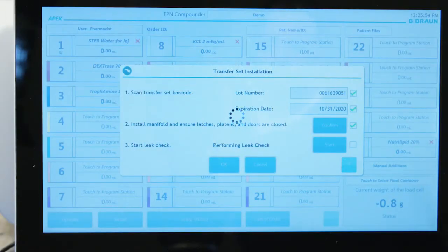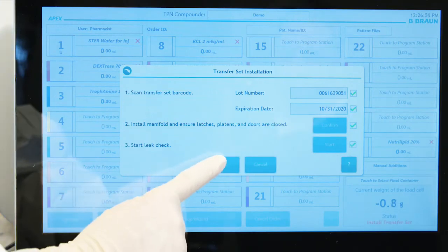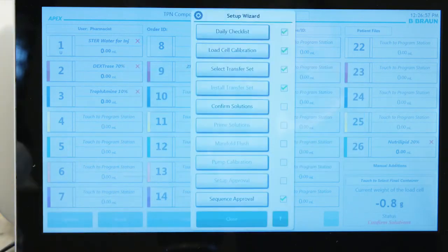APEX will then perform the second part of the leak check to ensure the integrity of the transfer set. When APEX has successfully completed its leak check, the OK button activates. Tap OK to exit from the transfer set installation screen and return to the setup wizard.